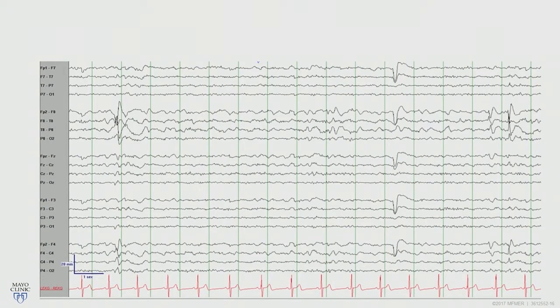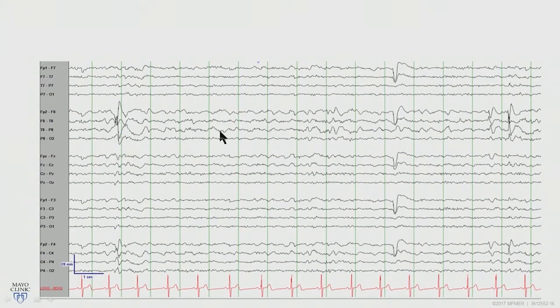This is an example of a right temporal discharge — perhaps this is a sharp wave. One characteristic of these sharp waves is the upstroke and downstroke: the slope tends to be steep and it goes below the baseline. You also see some slowing. So in addition to seeing these spikes or sharp waves, you do see other abnormalities, commonly focal slowing in that region.